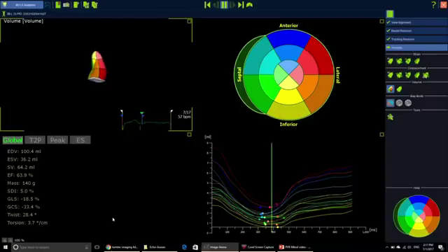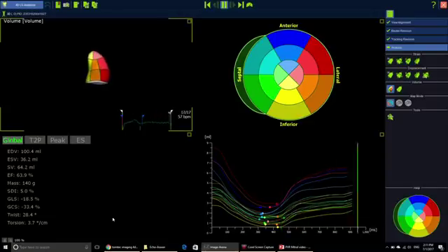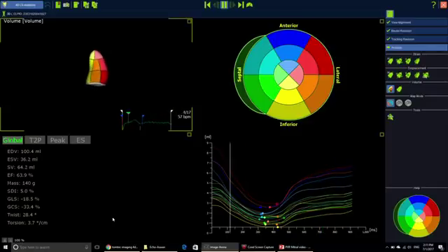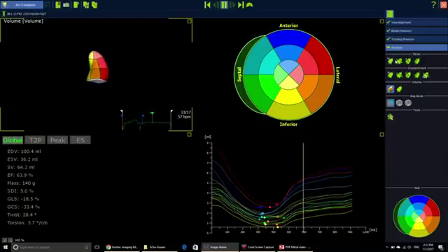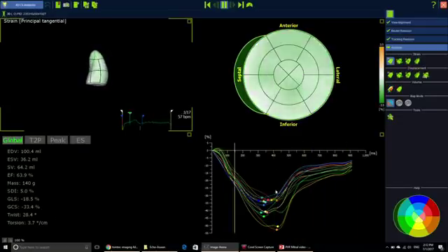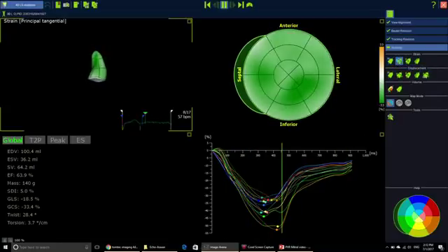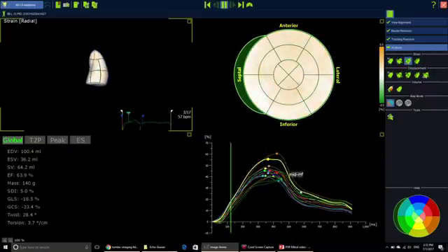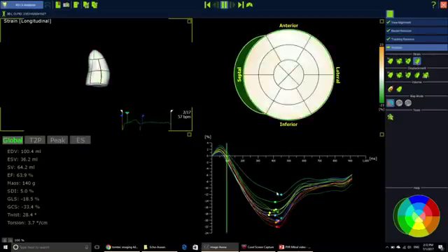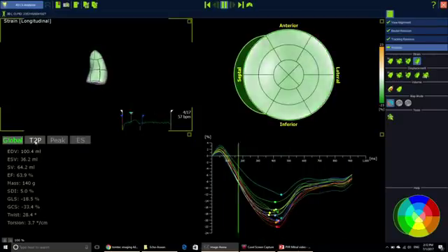Twist and torsion are still not fully validated at the time of this video, but if we are to trust them they should be derived from a 3D analysis rather than a 2D analysis where we track the apex and base in short axis separately — we all know the variability that can happen in those measurements. Calculating from a 3D volume analysis is more reproducible and more realistic. These are the 3D strain results: this is the 3D strain bull's-eye view, here is the circumferential strain, the radial strain — which is positive as expected due to thickening — the longitudinal strain which is negative, and here is time to peak.